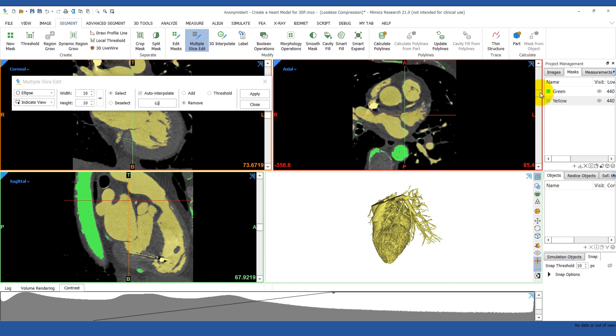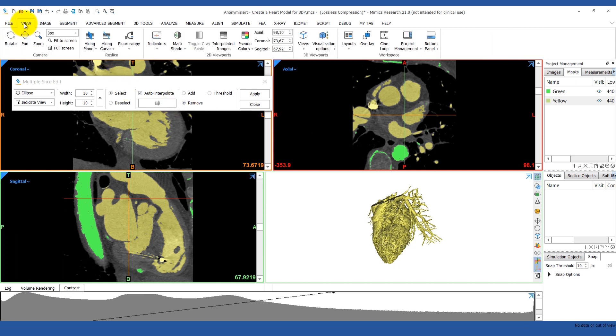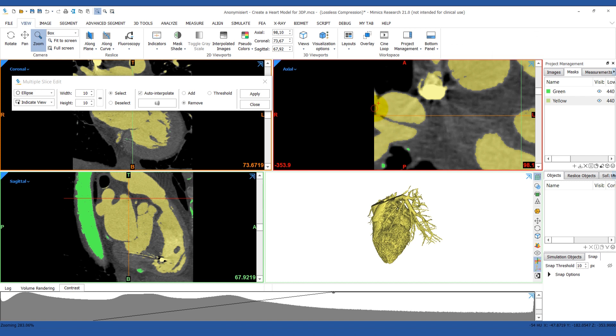We'll start in the area where there's a connection between the pulmonary artery and the pulmonary vein. We just take the brush and start marking the area between the two vessels.